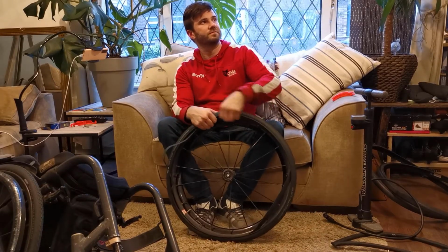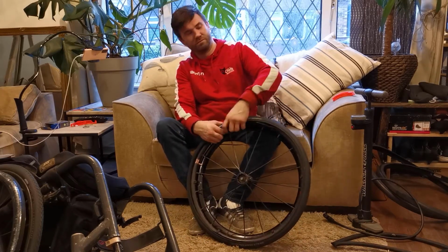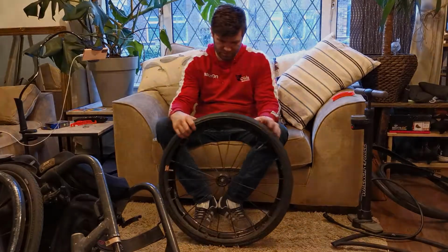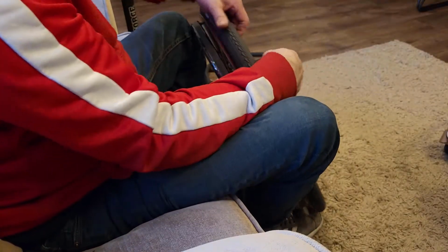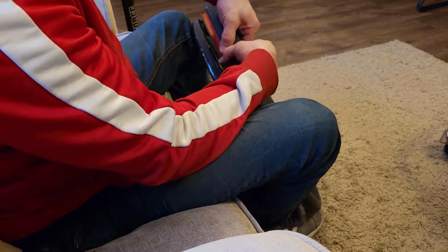You may find that the inner tube, especially a new one, feels like it's going to be 2 or 3 inches too long, but once you've actually got it in there and sat right into the tyre and with a little bit of air in it, it will be the right size, it will fit. It's just another angle of it here. You can see I'm just putting that last bit of the tube in.